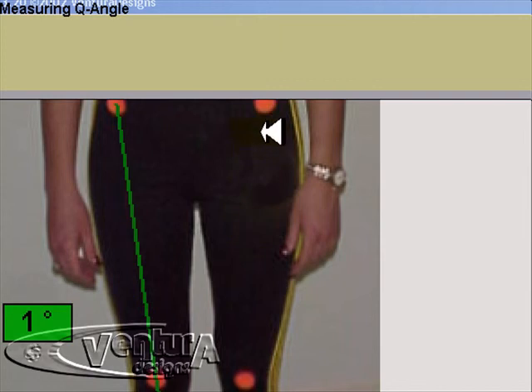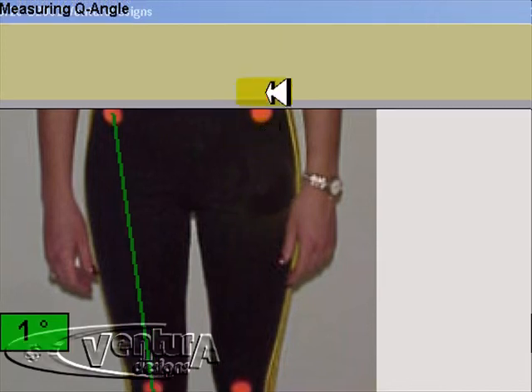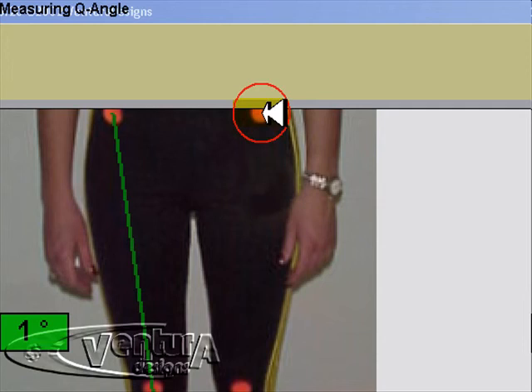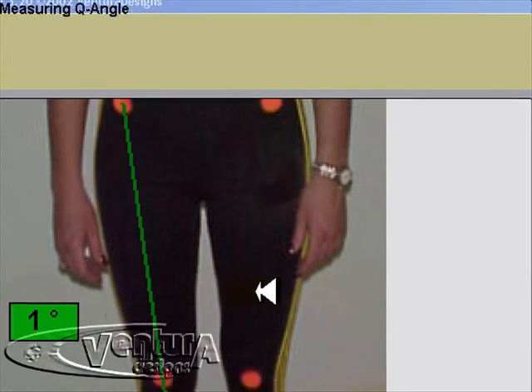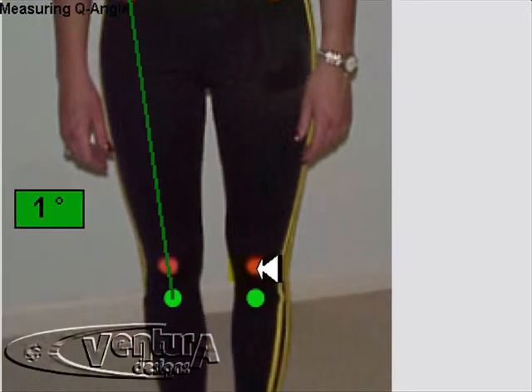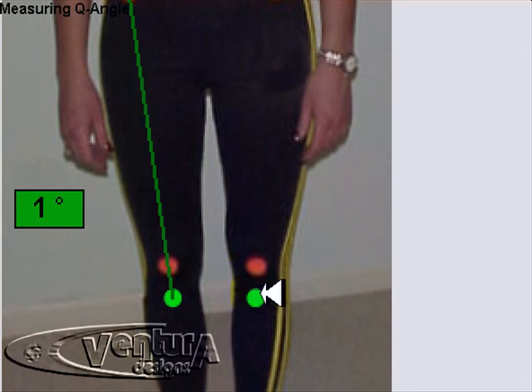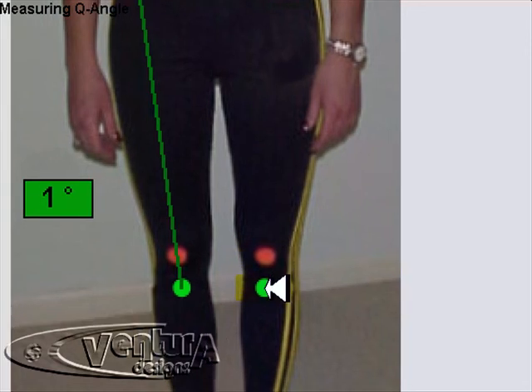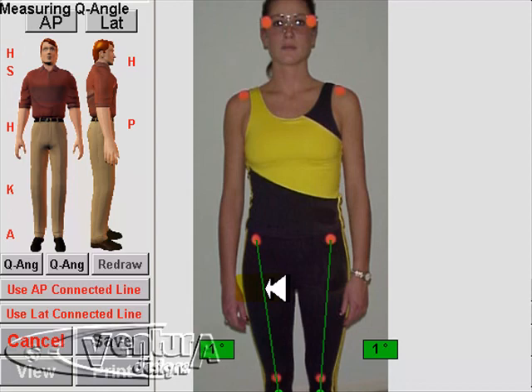Here we will make a click at the ASIS, another click at the center of the kneecap, and again the third click at the tibial tuberosity.